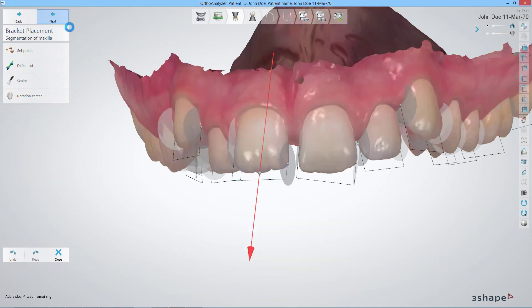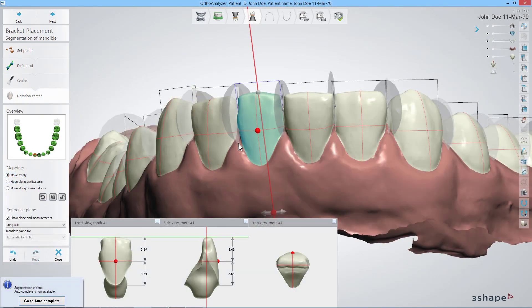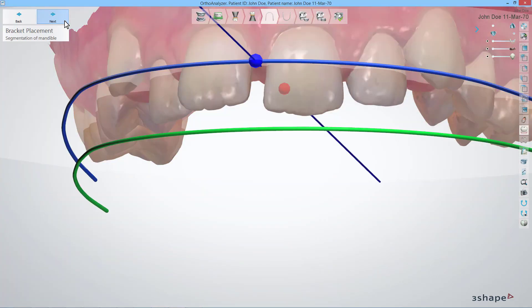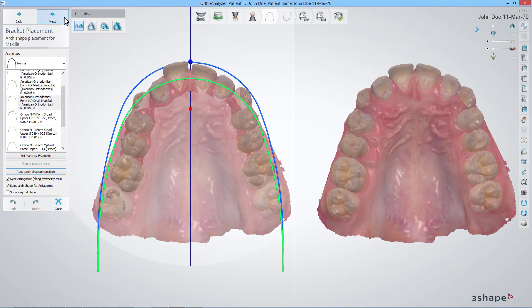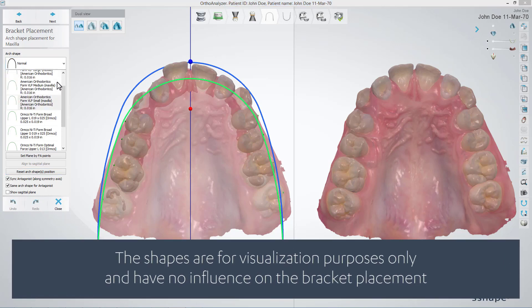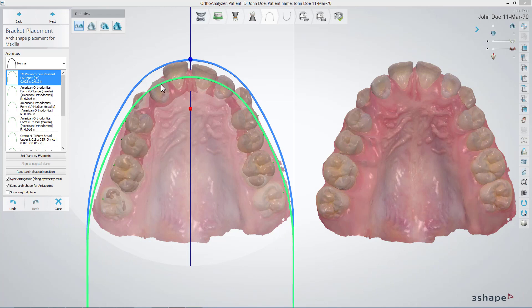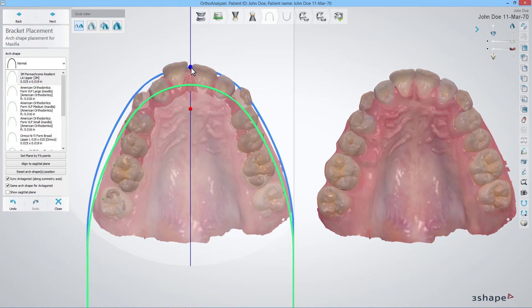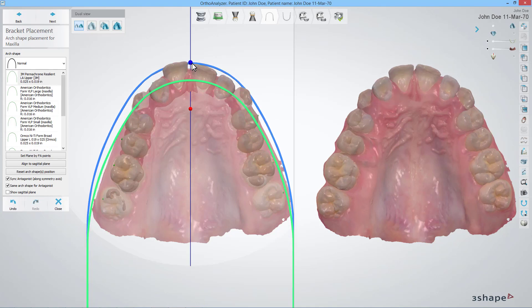If you've chosen to put brackets on both jaws, now you must repeat the same segmentation workflow for the antagonist. In this step, you will select the arch shape for the specific jaw. Click to select the right shape from the drop-down list, then select the specific arch. The blue arch in the left view represents this specific arch. The green one is the antagonist, shown just for visualization. Hold and move the blue control point to move the blue arch, and see the outcome in the right view.